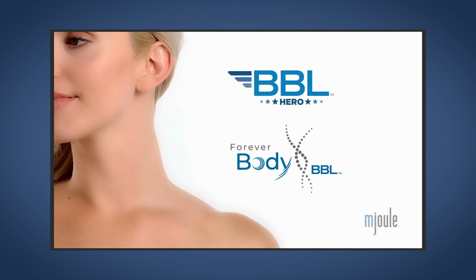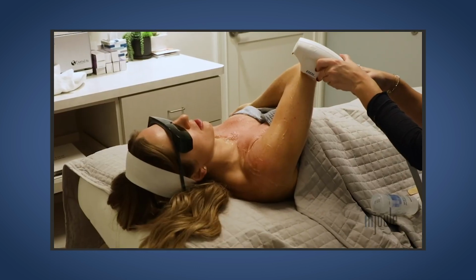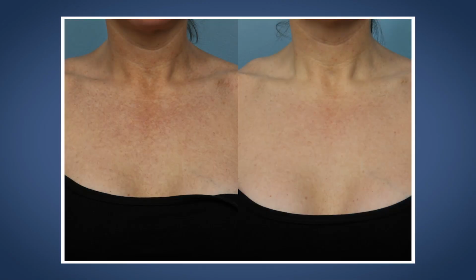You can deliver so many more passes at lower energy, but also that lower pulse width gets the energy in a little bit quicker, and you can do a quick treatment. I can't really tell from the image, but did she have some textural imperfections as well on top of it? She does a little bit. She complained of kind of bumpy, rough skin too. Then I would do the BBL HERO first, bringing up that pigment. You can see it immediately. And then perhaps do a level 2 or 3 MOXI or a very low level Halo on top of that. And so let me show you the before and after. So you and I are lockstep in the approach to this patient.